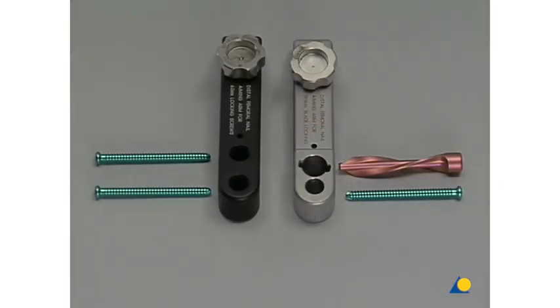The aiming arm is selected according to the planned locking method. For distal locking with the spiral blade, which will be demonstrated in this presentation, the gray aiming arm is chosen.